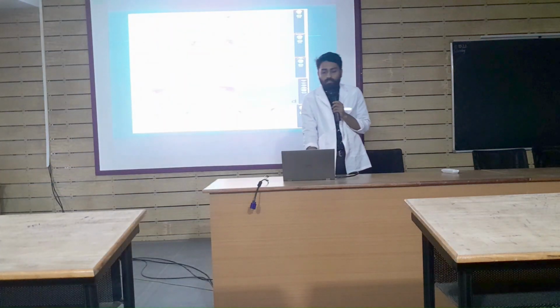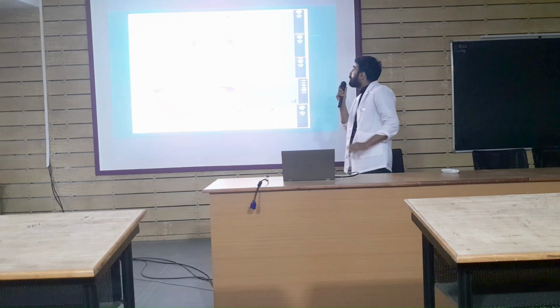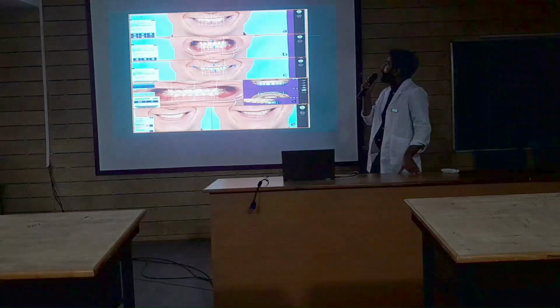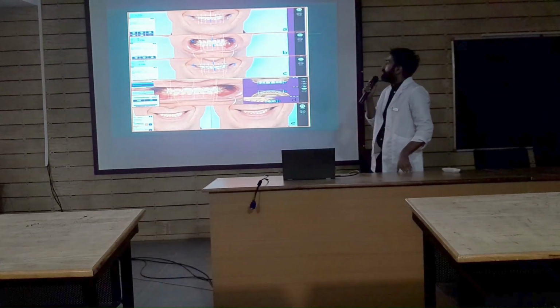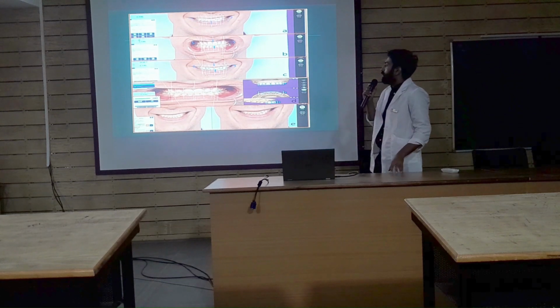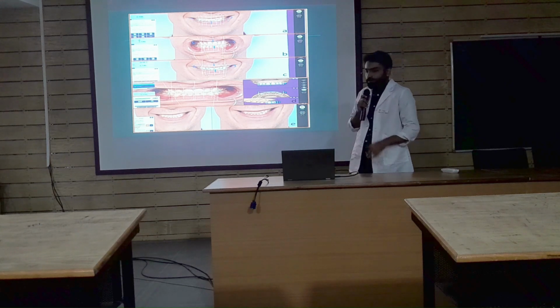So what we do is take a series of images, then we do the analysis. In diagram A, we do the extraoral analysis. Then there's the dental analysis. Then we do the intraoral analysis. Then in diagram C, we create the smile of the patient. We compare both, and in diagram E, we can see the difference between the digitally created smile and the original smile of the patient.